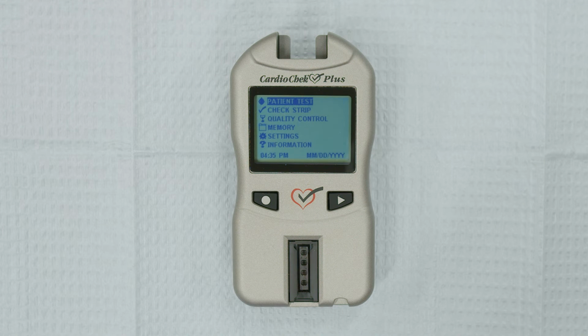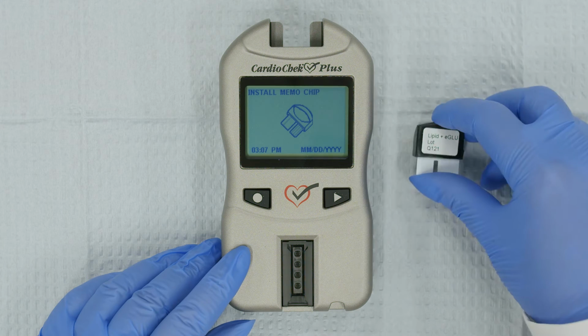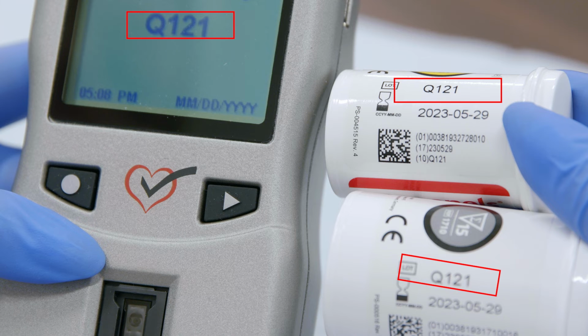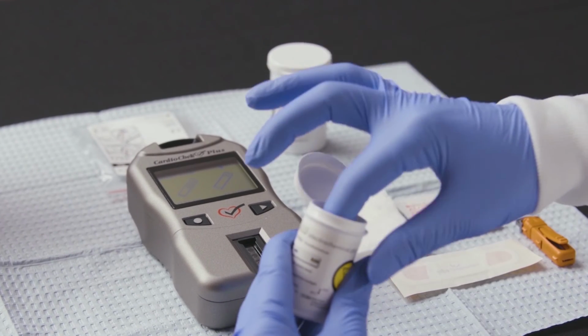Patient Test will be highlighted in the main menu. Press Enter. Install the memo chip as instructed on the analyzer screen. A lot number will appear. Make sure that the lot numbers on the screen, on the memo chip, and on the test strip vials match. Set the analyzer on a flat, stable surface.